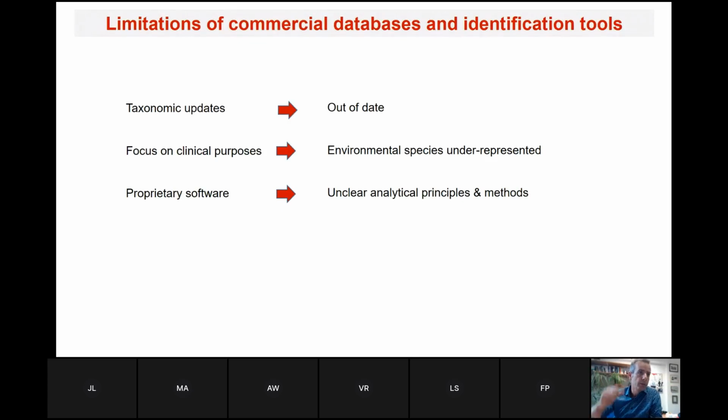Another issue is that the commercial databases focus mostly on clinical strains. So if you're interested in non-pathogenic or environmental species, they are typically underrepresented in these databases. Also, the software is proprietary, which means the analytical principles and methods are not very clear.